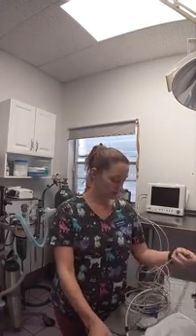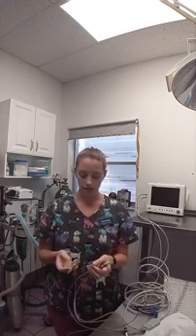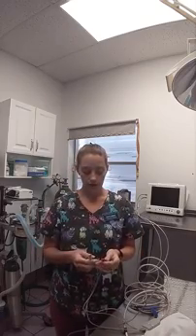Another one of our monitoring devices is the EKG, and it is transmitting the electrical impulses of the heart. So it's going to not only have a heart rate where you'll be hearing a beep noise every time the heart beats, but also transmitting a waveform that you could make sure is normal, or if there's any abnormal wave to the heart rate.